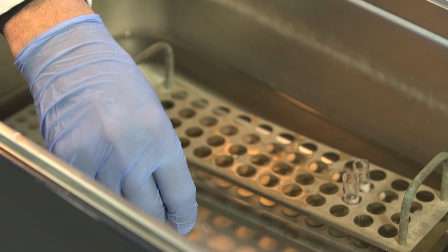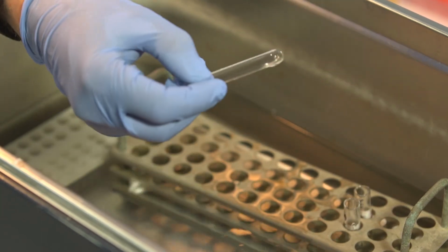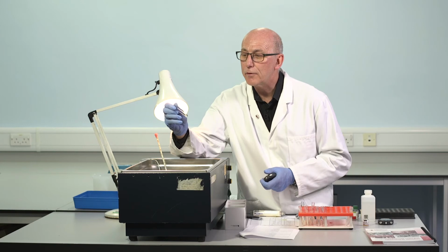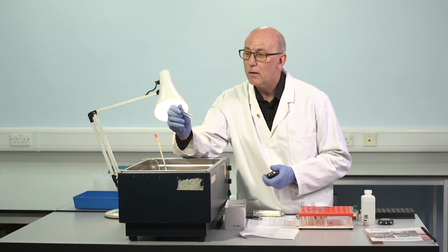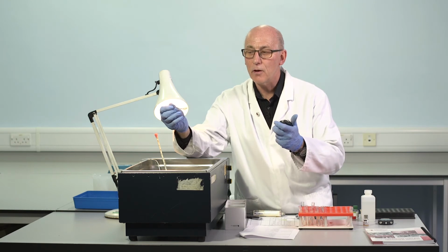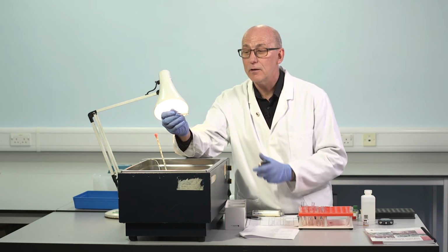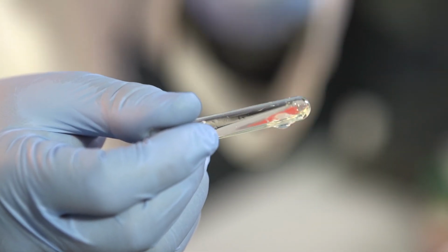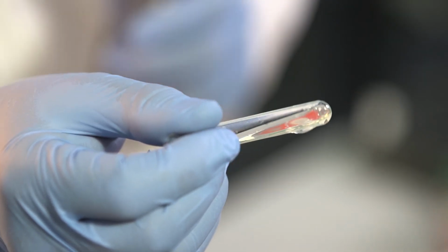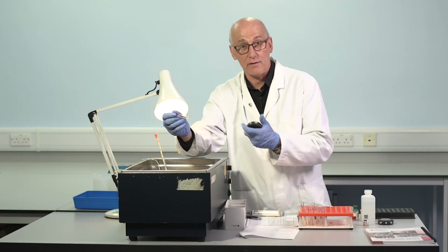So remember, this is deficient plasma, simply with buffer added, followed by APTT reagent and calcium. And we're looking for a clotting time. Aha. And we have a clot. It's a particularly prolonged clotting time, well, 142 seconds. And when it's particularly prolonged, as in this case, the clot is rather weak. It's rather wispy. And that can sometimes cause problems on autoanalyzers, but I think with experience it's possible to recognize that this is indeed a clot during the manual method.